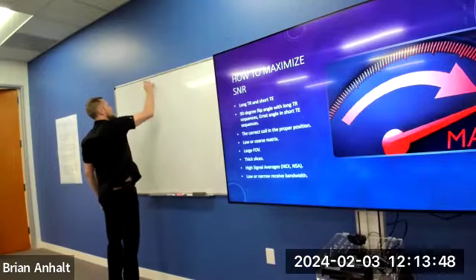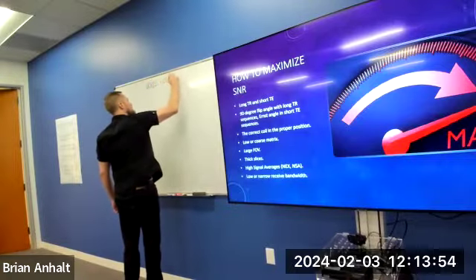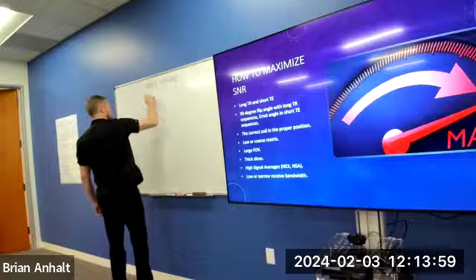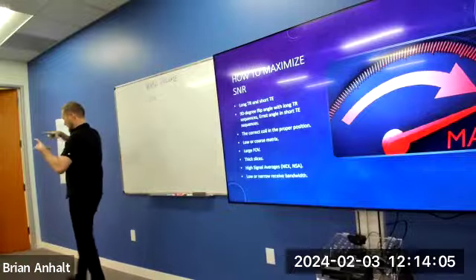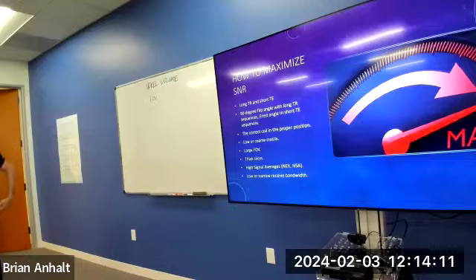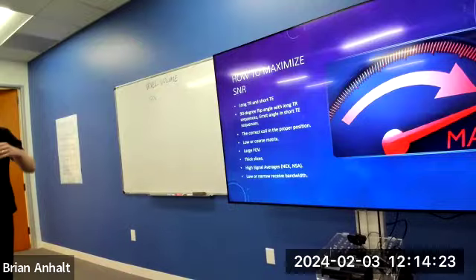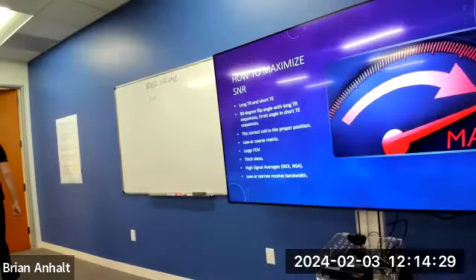So voxel volume is controlled by three parameters. One of them is split into two different ones. We have our field of view. Think about the field of view as the size of the picture you're taking. You're going to have larger fields of view if you're going through larger anatomy, right? If I have to do an entire femur, it's a pretty large field of view, at least in the coronal and the sagittal plane. Axial can be smaller, right? Head is going to be smaller. If you're doing a wrist, it's going to be a much smaller field of view. So think about it as zooming in or zooming out, just to encompass all of the area that you need to scan.